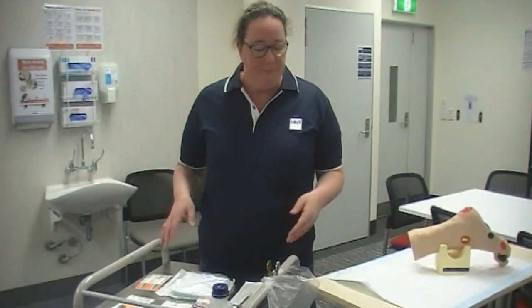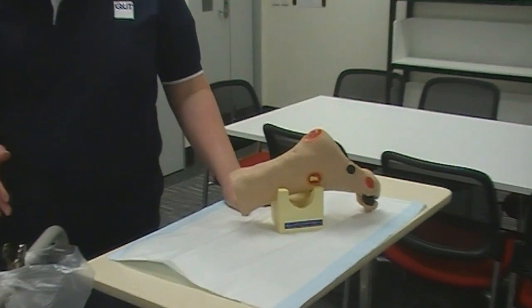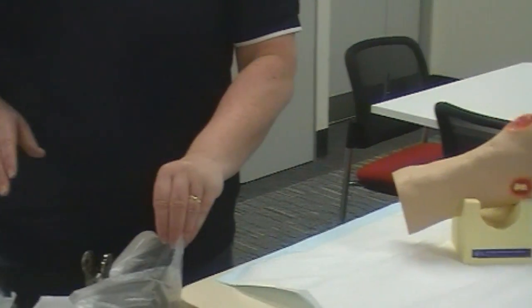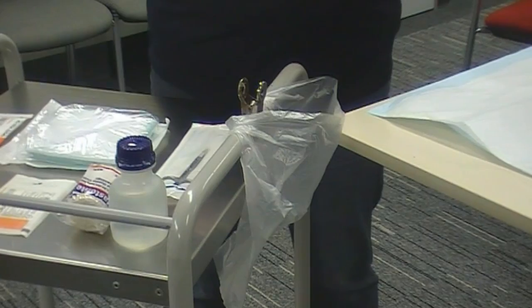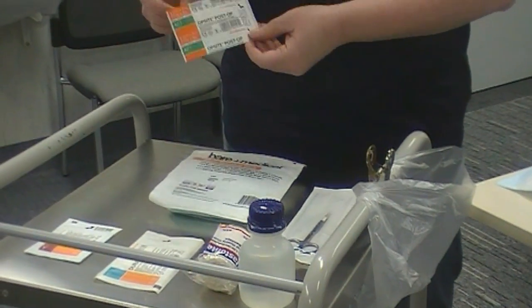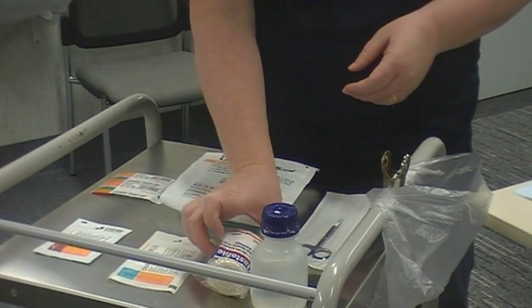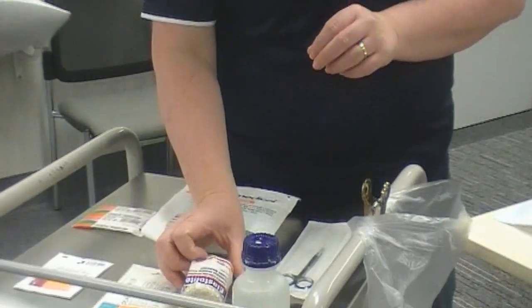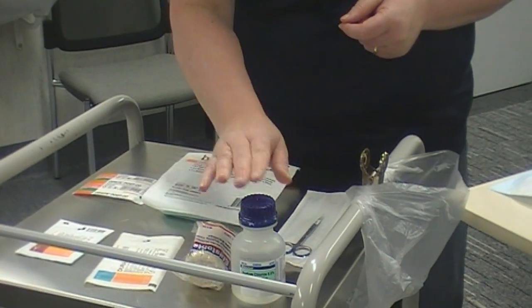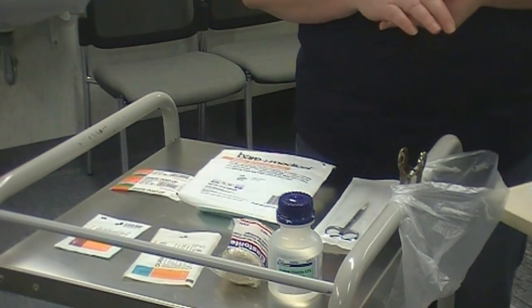I've already gathered my gear and we've already set our patient up on our bluey here, which we would use in all circumstances to ensure we protect the bed from any spills. My plastic bag is on the side of the trolley closest to the patient, and I've collected my dressing pack, an op-site to cover the wound at the end, a Dura Fiber, bandage, my cleaning fluid — which for today is normal saline — and a pair of scissors to cut the Dura Fiber, and I've also got an extra Melalin.